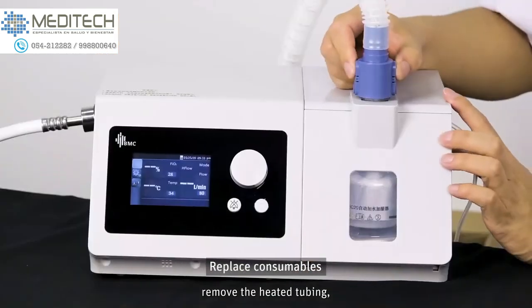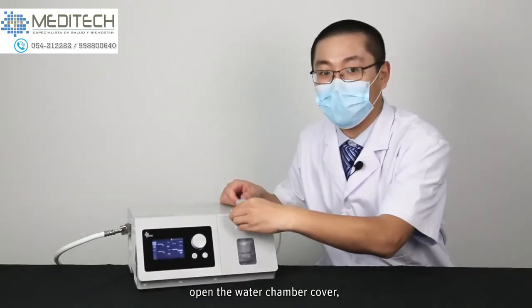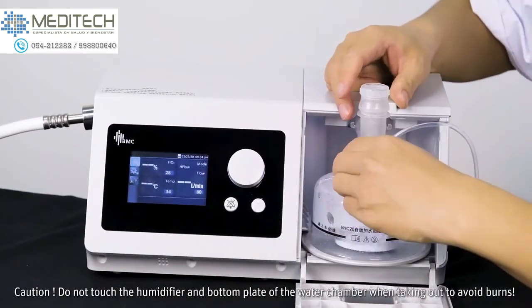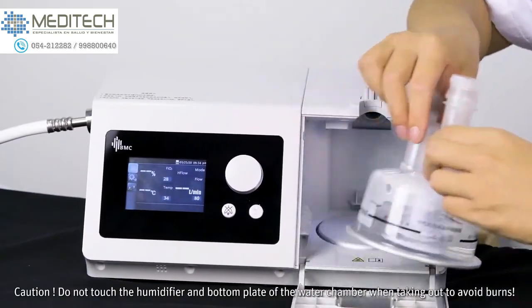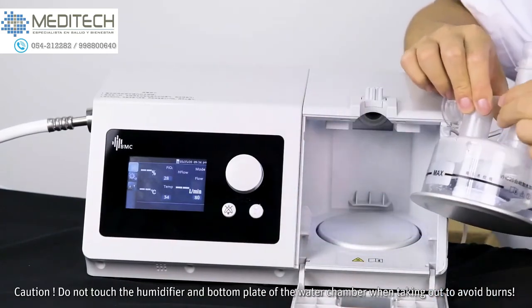Remove the heated tubing. Open the water chamber cover. Press down on the chamber and remove it. Caution: do not touch the humidifier and the bottom plate of the water chamber when taking out to avoid burns.